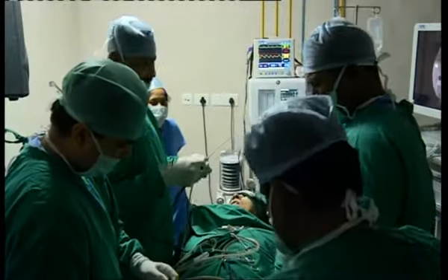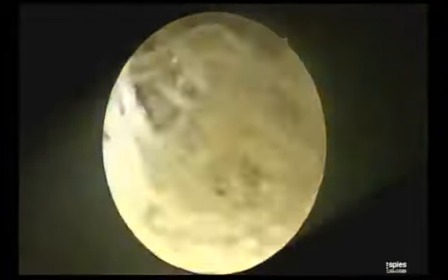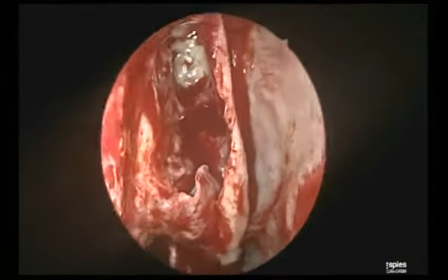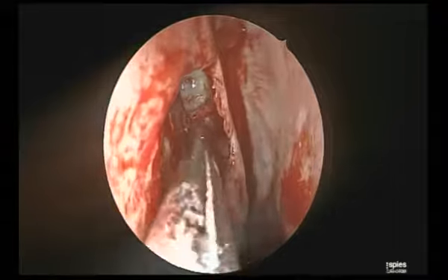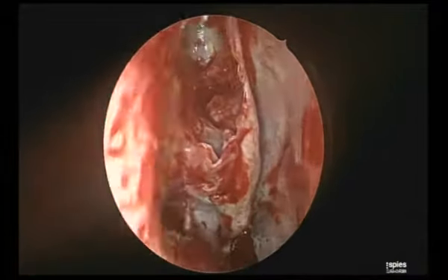0 degree. Tell that in the next case. Sit there. Sandeep, I have to tell you so much. You're not using your brain. I have to tell you, sit straight. What are you doing? If I need to ask to change the instrument. Dr. Naidu is operating. He is, I think, a first year MS ENT, but extremely dedicated and already very skilled. I'm sure he's very committed to his professors in this medical college. He follows Satish everywhere.